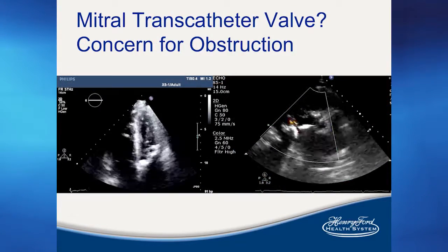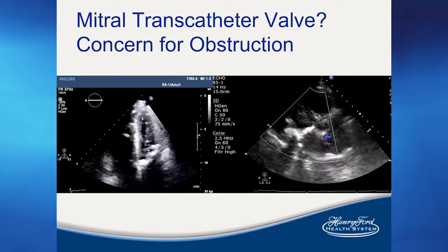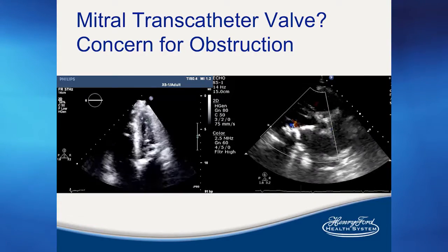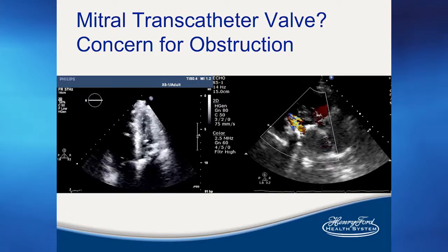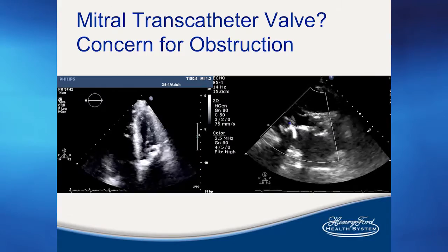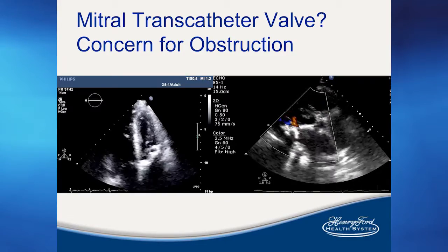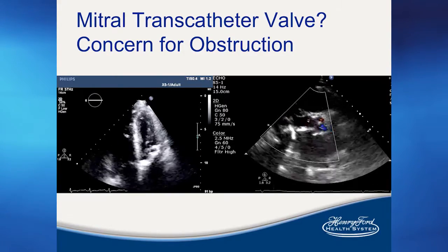So we thought about creative ways to tackle this problem, because just like people with aortic stenosis, some of these people have some functionality, and they're desperate for some solutions. And we asked ourselves, well, if it's so calcified, can you put a valve in there? As you can see in this parasternal long axis view, it's very crowded here, and we've had to come up with some unique solutions for that unique problem.